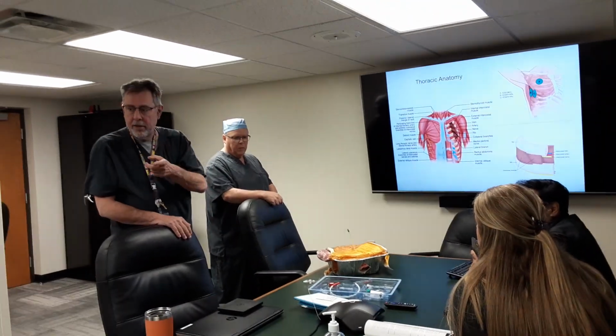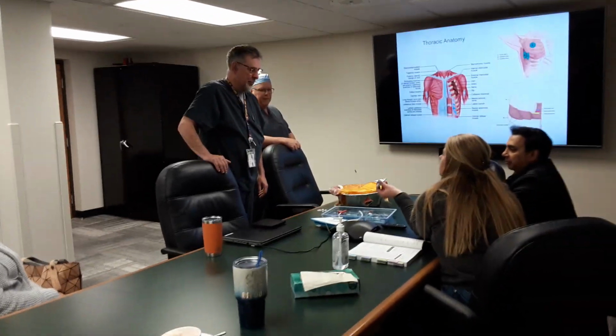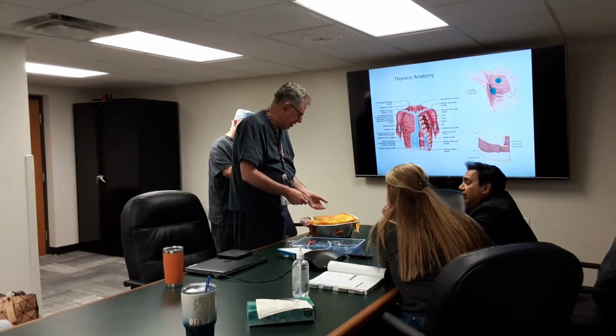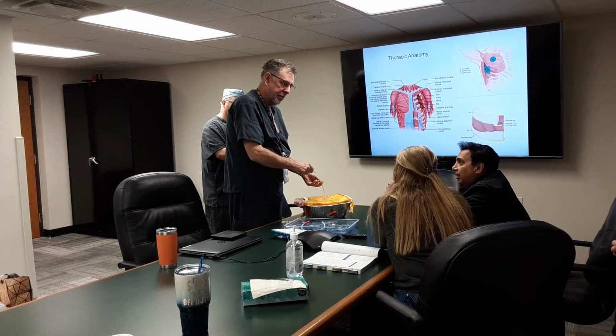Somebody make a kazoo out of it. Now you guys are done, and now we have to manage that. Where does this go? Well, you're going to have to have an adapter. I don't see it in this kit, but you're going to have to have an adapter that will hook up to this. It's not a plumbing job.